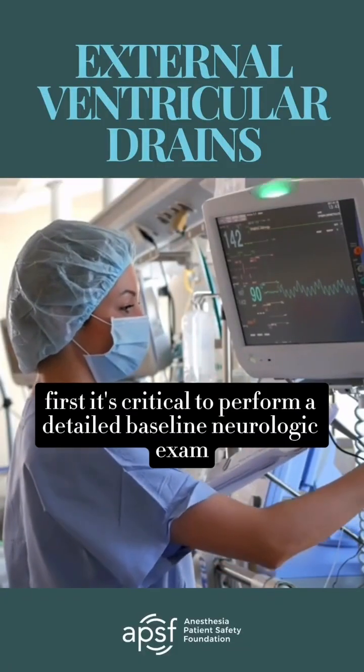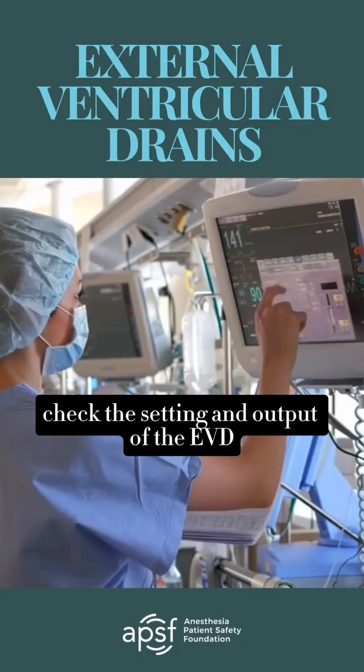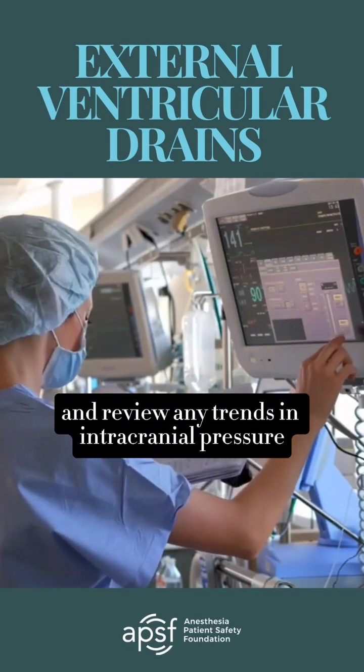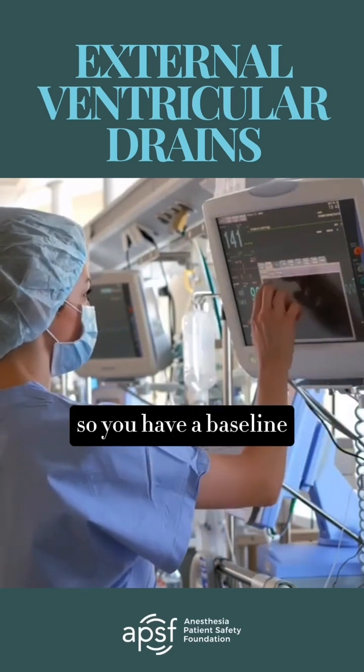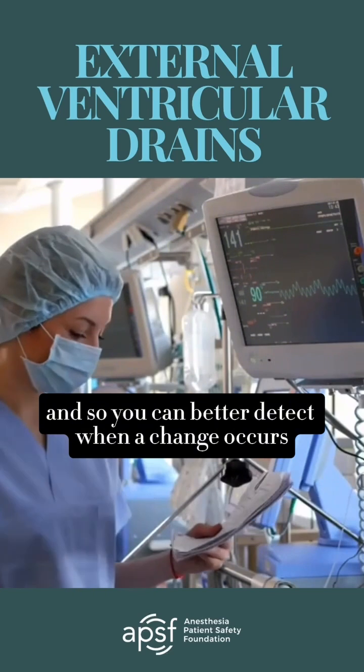First, it's critical to perform a detailed baseline neurologic exam, check the setting and output of the EVD, and review any trends in intracranial pressure and cerebral spinal fluid characteristics before surgery, so you have a baseline and so you can better detect when a change occurs.